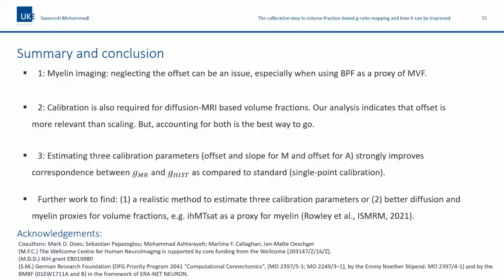Obviously, fresh tissue will be a lot better to work on. The main problem with fresh tissue is that if you are doing such a long acquisition, your tissue will be changing over time, and we want to put into this fitting data which is in the same state, and that is very difficult to accomplish with fresh tissue. Okay, thank you.